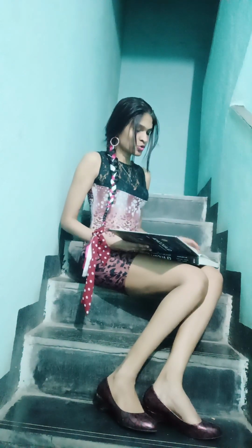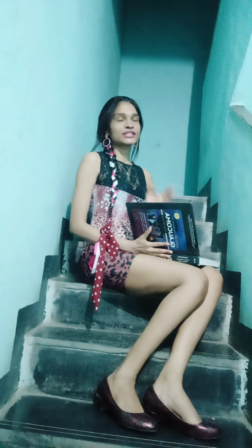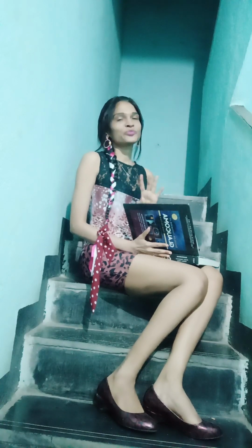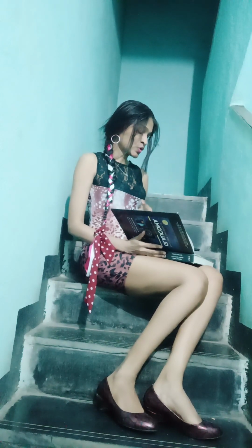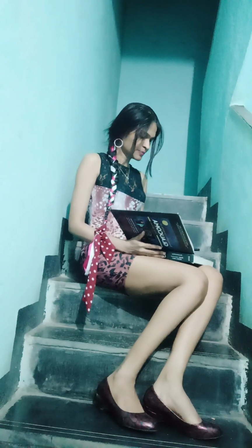Okay. So what they are saying is, there are different types of indirect gonioscopy lenses. Koeppe was a prototype of the direct gonioscopy lens, and indirect lenses are either single mirror, double mirror, three mirrored, or four mirrored. Okay, so there is a Goldmann single mirror lens, and it is tilted at 62 degrees. Then Goldmann's three mirror lens is there, two for examination of the fundus and one for the examination of the angle. Okay.